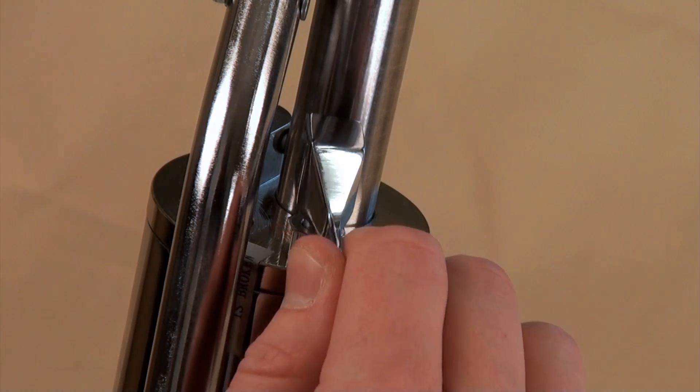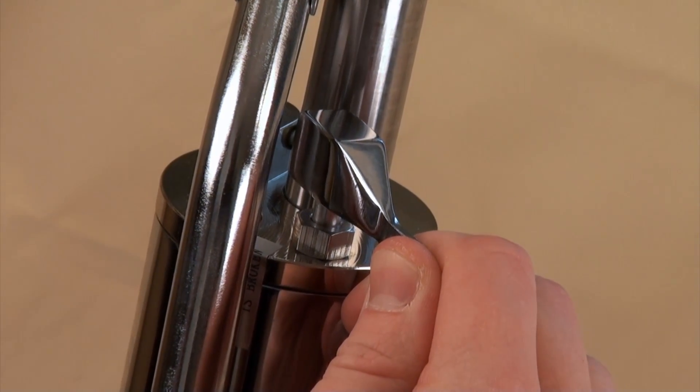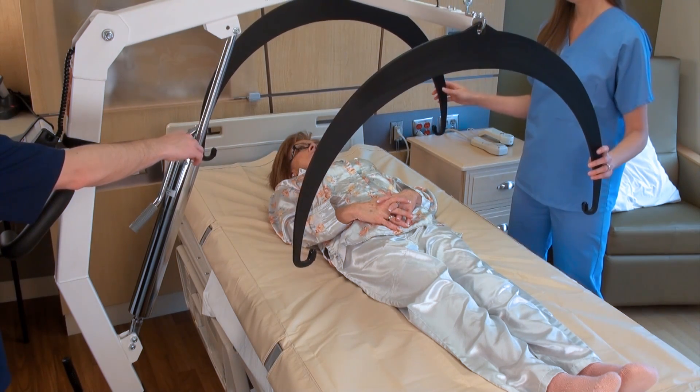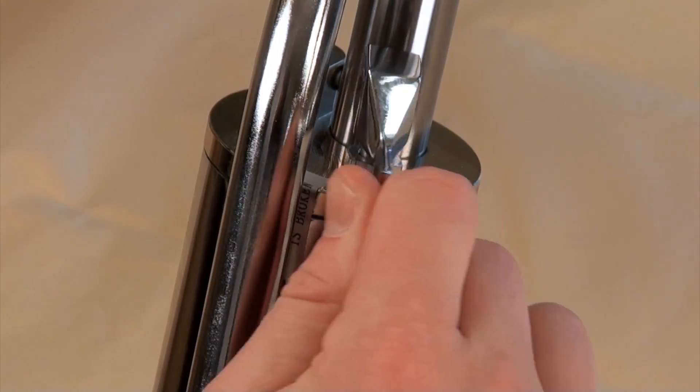Turn the hydraulic cylinder release valve counterclockwise to an open position, which will slowly lower the scale's arm until the support hoops' hooks reach the mattress. Close the valve to hold the position.